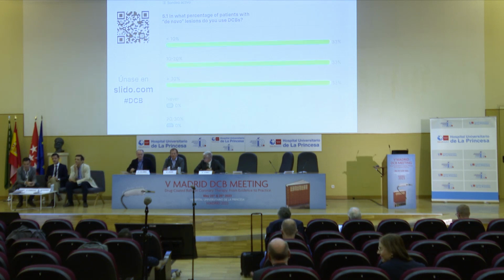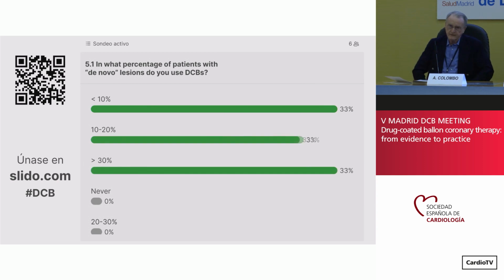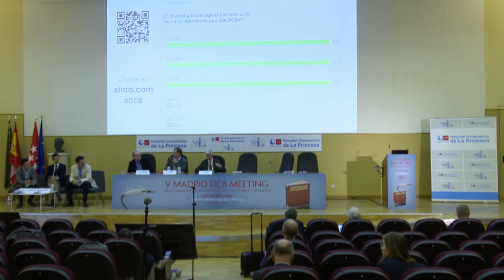Okay. In what percentage of patients with de novo lesion do you use DCB? Okay, 40. Okay, 30%. I think 30% is fair. But you could even rephrase the question: in what percentage of patients with de novo lesion 3 millimeter or bigger do you use DCB? Next.